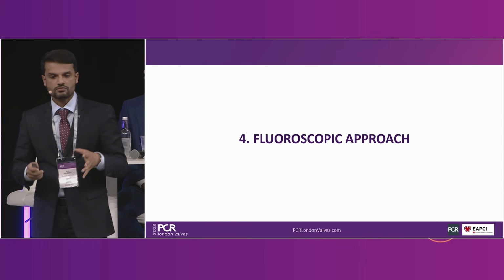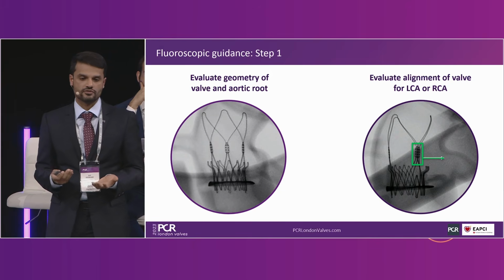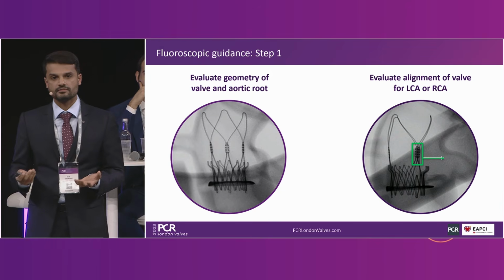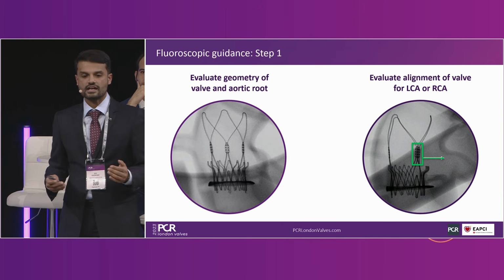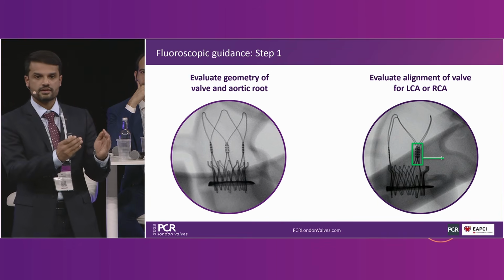And just to end now, again, coronary access, we talk about which catheters, which techniques, but I think we can take a step back, and someone mentioned earlier about fluoroscopy. I think it can be quite useful if you've got time to evaluate the problem, evaluate the challenges you have in front of you. What's my aorta like? How high are my coronary arteries? How much space do I have?